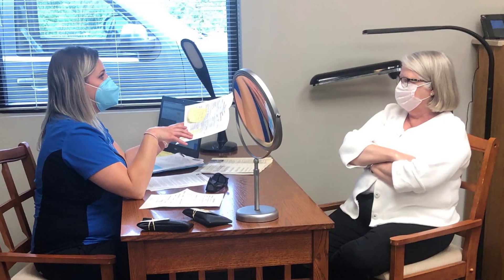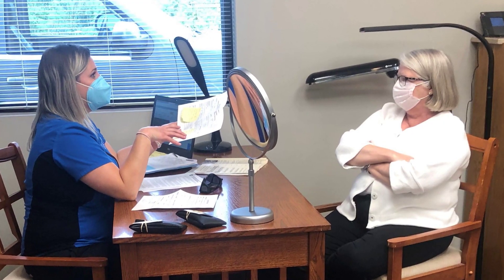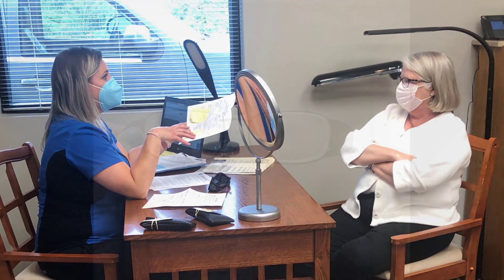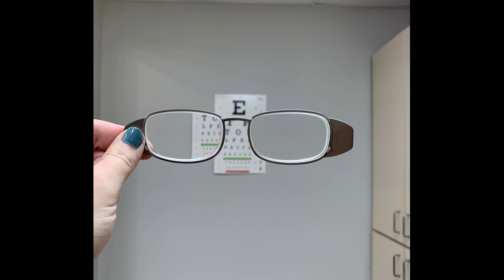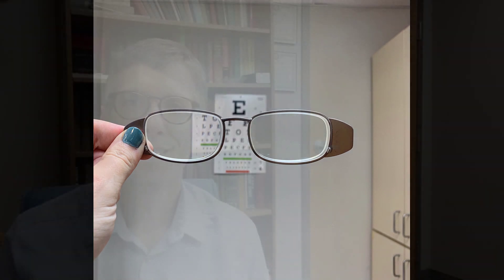That's the side vision awareness glasses system, and it also comes now in a full field version. Another patient I helped picked up her glasses this week. She had a quadranopsia and was having some difficulty reading on the computer, but also just books — and that system is great for reading. So there you have it: examples of patients with peripheral field loss who can be helped in dramatic ways. Without your referrals, these patients wouldn't get help, and helping these patients is the most rewarding thing that I do.